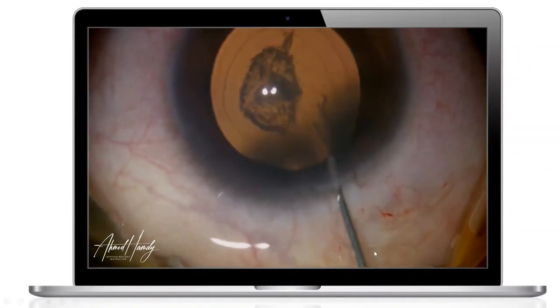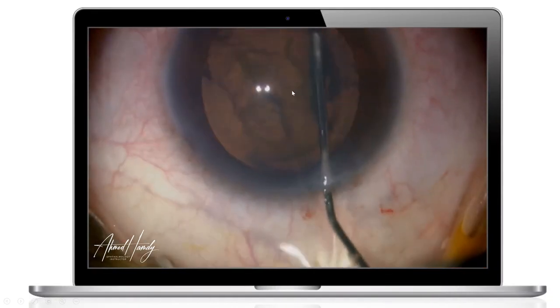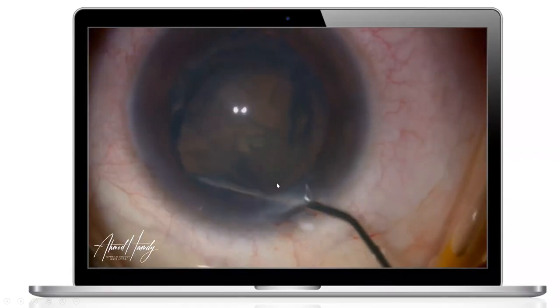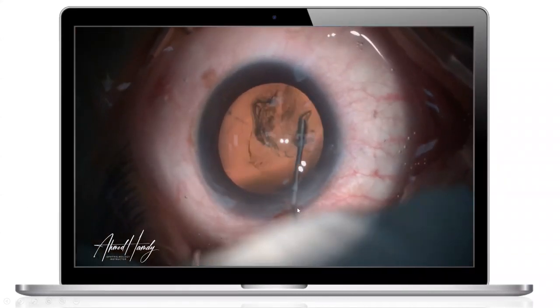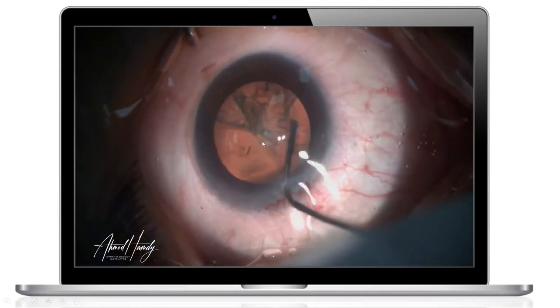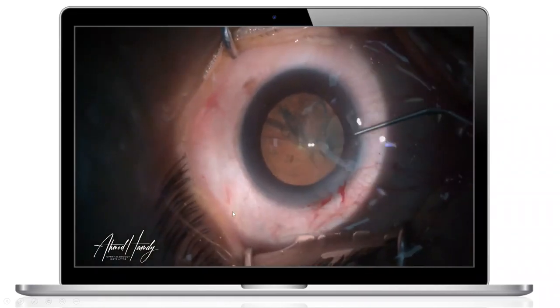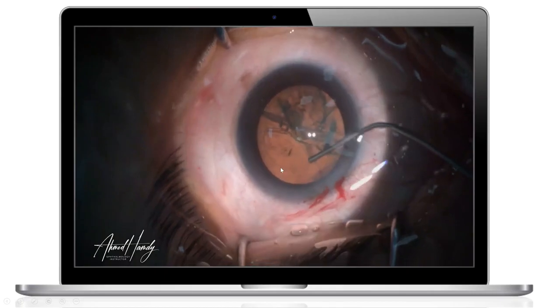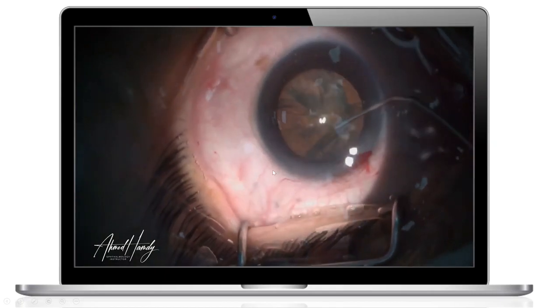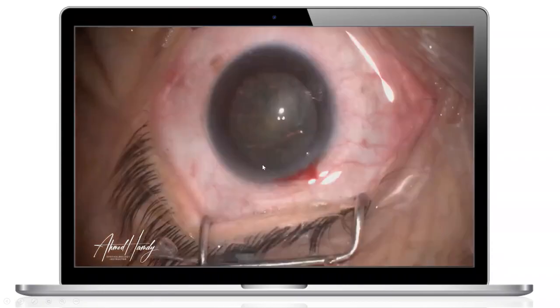You see this, we're just pressing on the posterior lip of the wound, and now passing the needle under the anterior capsule edge and doing this injection. It will create these waves, meaning that there is a separation of the lens. Just press on the posterior lip of the wound, then inject. And in order to make sure that the nucleus is freely mobile, we do rotation. Here you see that the subincisional area is not rotated. So here we inject into the subincisional area.